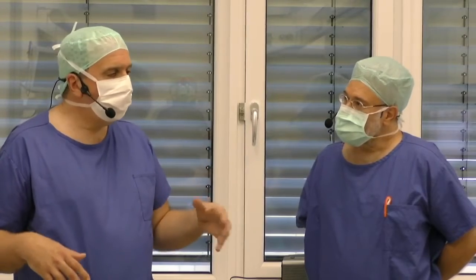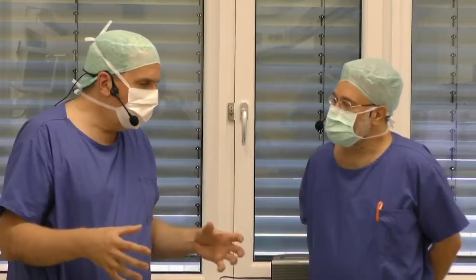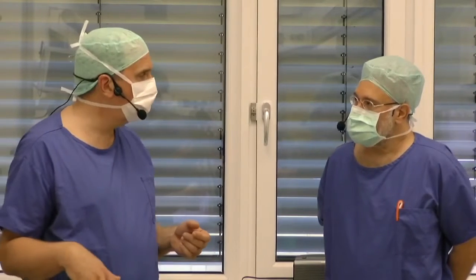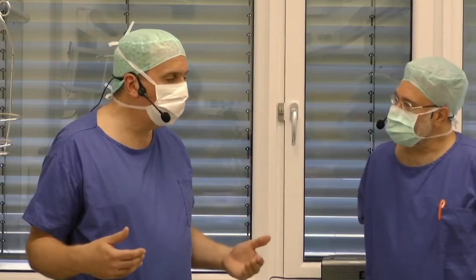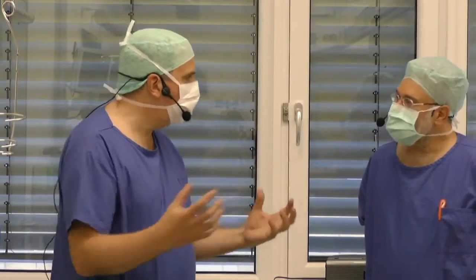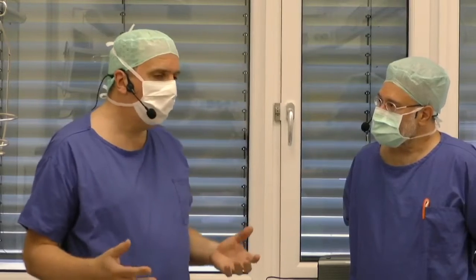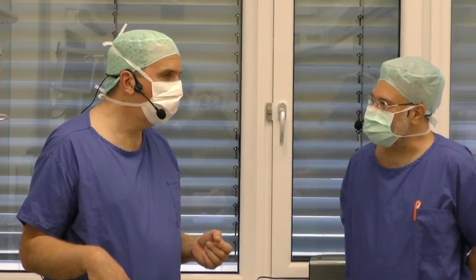And the nano laser, the surgical system, also fits in this procedure and in this strategy, because it's less traumatic to the eye, which is very important if you do both eye surgery. What do you mean by less traumatic? Less traumatic means small incision, no thermal gradient, no mechanical shockwave-like effect. Absolutely less energy given inside the eye compared to phaco. I've noticed that this eye was performed with under 500 microjoules of energy.